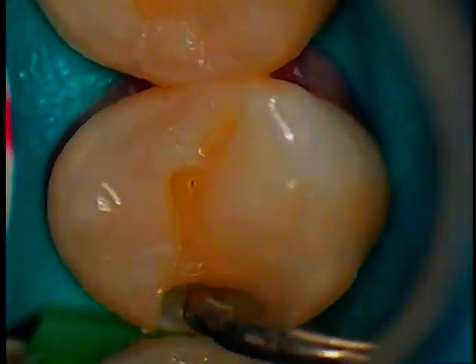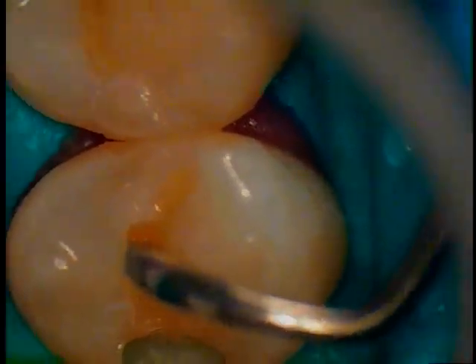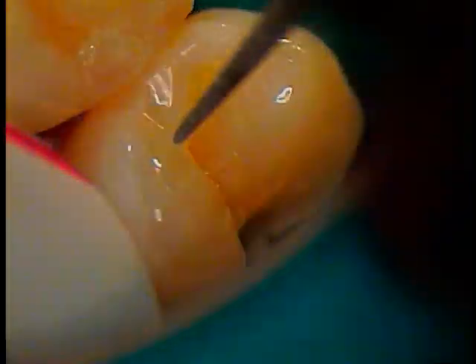Okay. Now, before I put the band, let me get rid of that. There it comes. Hang on, that's just a smidgen. I get that.